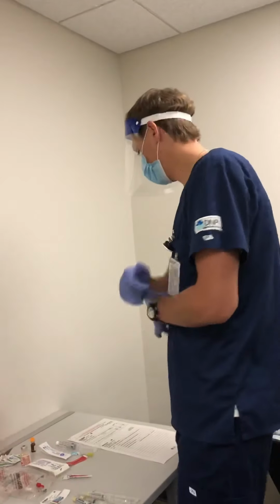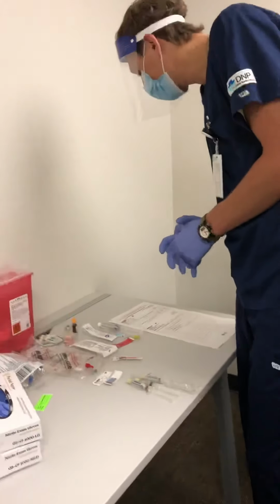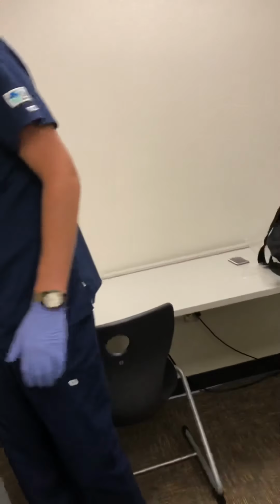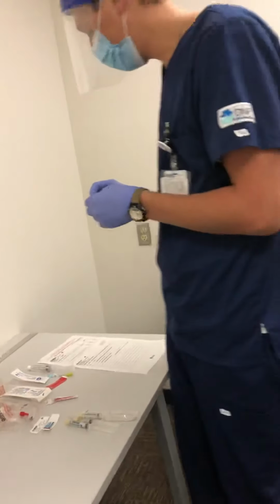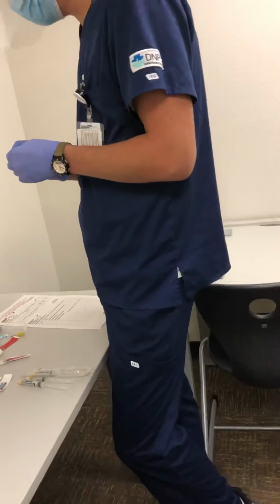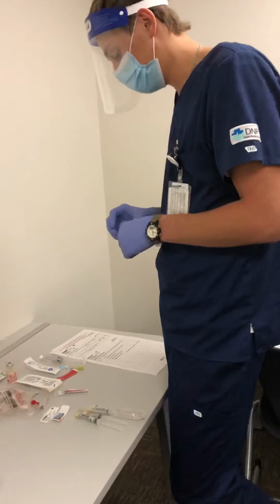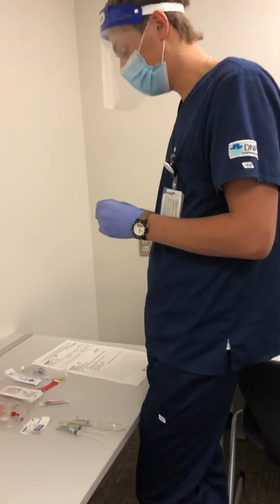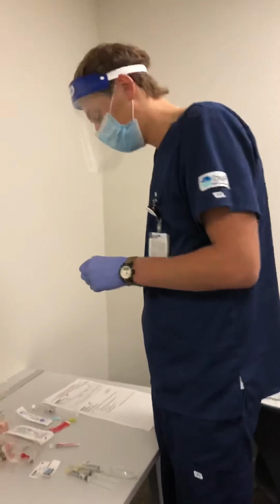So the first medication I'm going to pull today is the morphine sulfate. I have it at 4 milligrams IV push. So I'm going to go ahead and grab this morphine. It's at 10 milligrams per milliliter, so I know through dimensional analysis I'm going to need to get 0.4 mL to get my 4 milligrams. I'm going to make sure that this morphine hasn't been tampered with, that it isn't expired or anything like that. Okay, so this is ready to go.